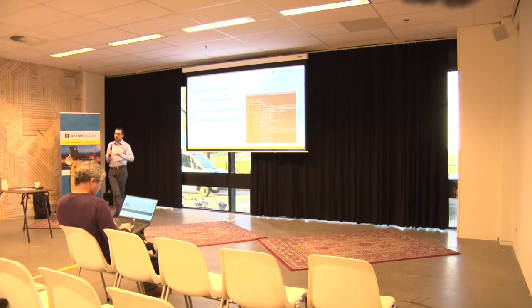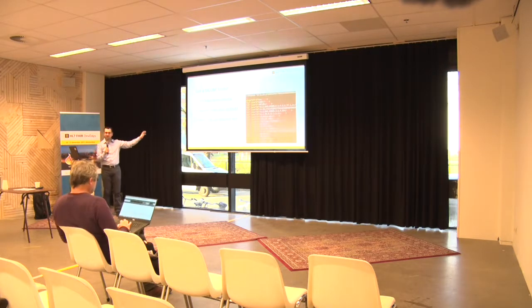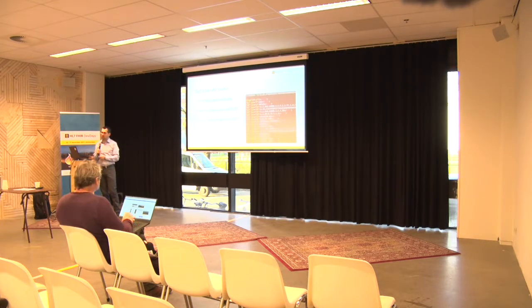Now the toolkits come in all shapes and sizes here. So this list I'm giving you here is essentially my favorites from a very, very long list of toolkits. And I should also mention, if there are any developers in the room, a lot of these toolkits are open source, and there are even more libraries that are open source you could use. So if you want to incorporate anything into your code, there's always something out there, okay? I'll just quickly go through them. If any of you want to download, the first one I usually would start with is DVTK. But you're more than welcome to try any and see which one you like the most.